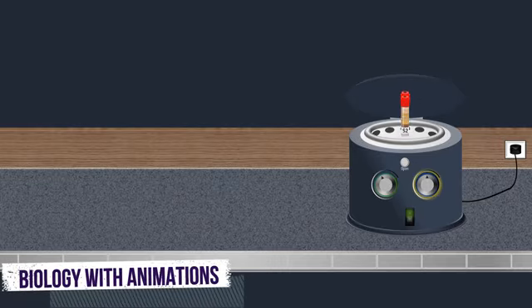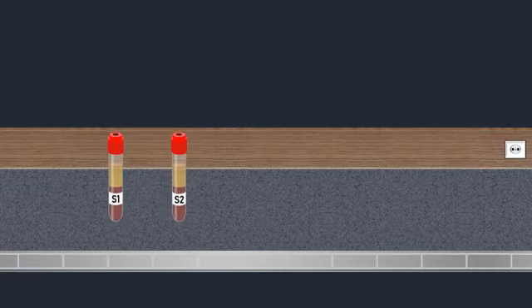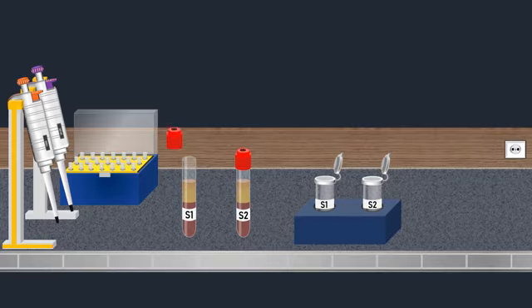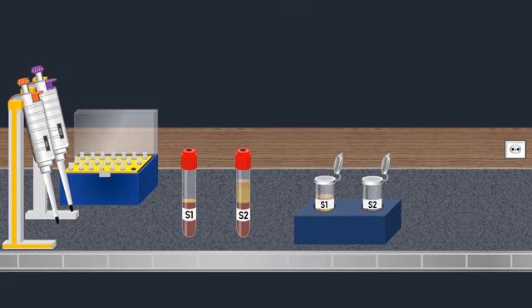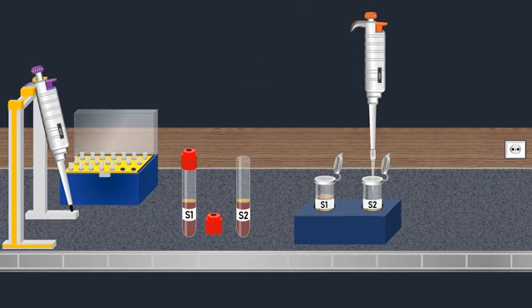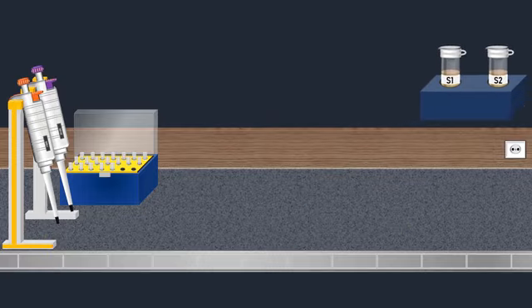During centrifugation, the blood components separate based on their density. After the centrifugation process is complete, the serum layer is carefully removed from the tube. The serum is then transferred into a new properly labeled tube for further testing. Finally, the samples are appropriately stored in a designated area until they are ready for analysis.